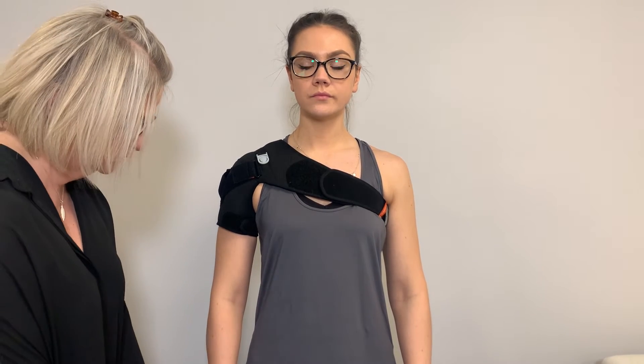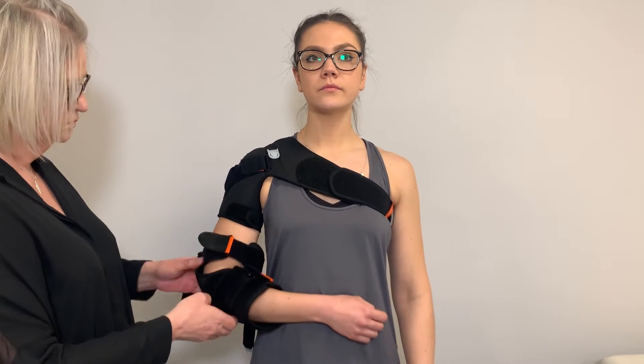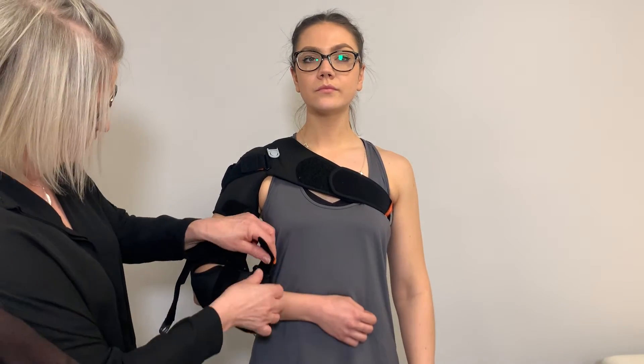The arm section must be applied so that the circular opening lies over the tip of the elbow. The lifting strap should face the direction of the shoulder joint.